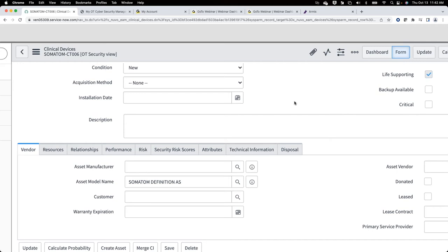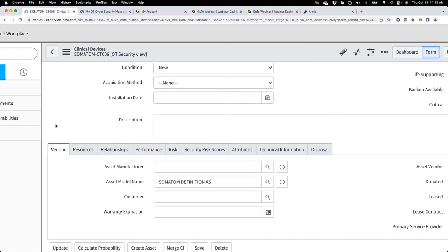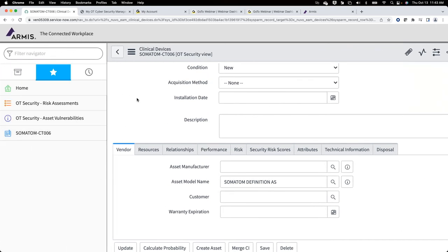Right now, as it stands today, when Joint Commission shows up, they're not asking you to open Armis, they're asking you to open Nuvolo. So you want that to be your complete system of truth. Whether or not that changes in the near term, because Joint Commission is starting to look at certain cybersecurity elements, just wait for the new EPs, everybody. So that's for a newly discovered device.